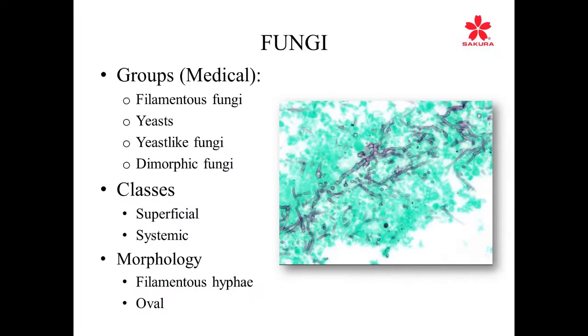So once again, on the last slide and on this slide, from 0 to 10, you can actually put down just what your assessment is. And we're going to discuss this a little bit later also. So silver stains are primarily used for, well, one is for the medical groups of fungi.